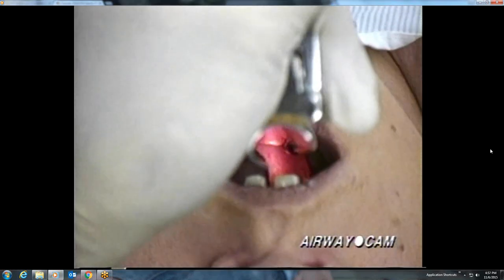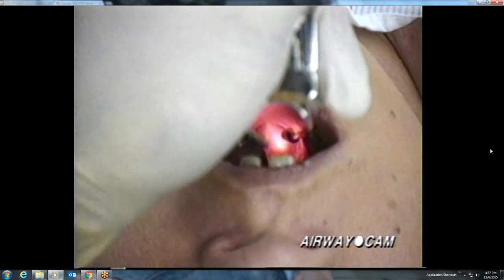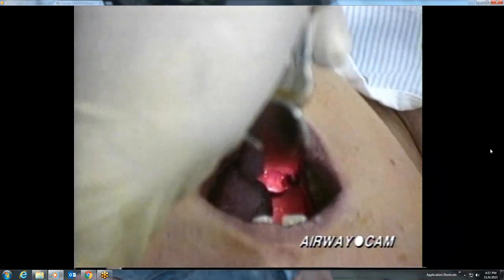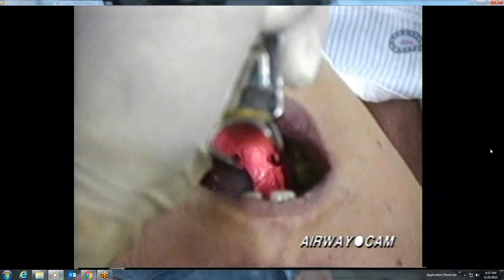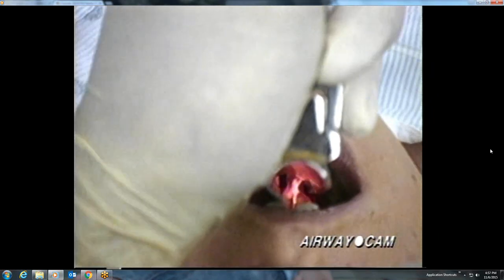Repeat laryngoscopy on this same patient begins with much better control of the tongue. Although there are multiple efforts at elevating the epiglottis in this case as well, there is a wider area for visualization because of better tongue positioning on the left side of the mouth. Once the epiglottis is controlled, there is a good view of the posterior cartilages, one vocal cord, and the glottic opening. Passage of the tube down the right side of the mouth and into the larynx is accomplished without difficulty.